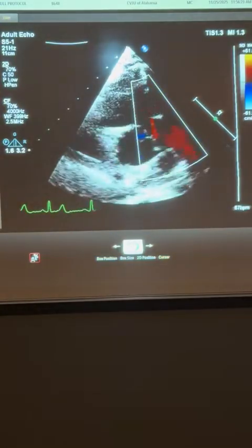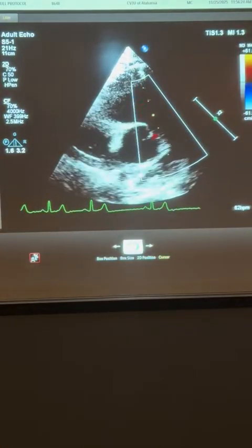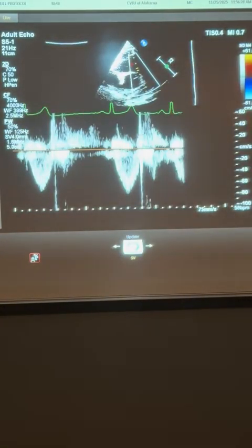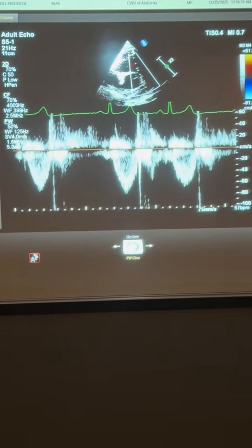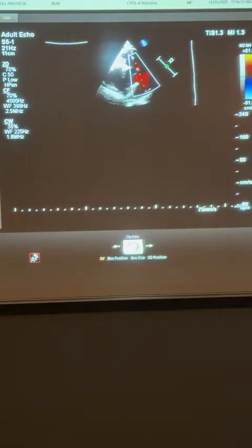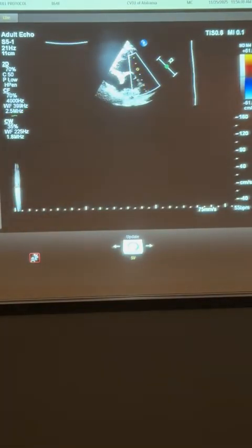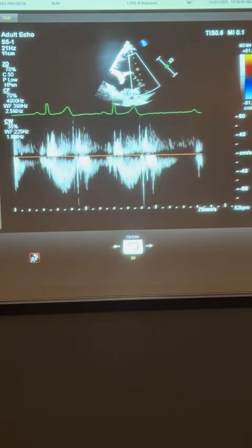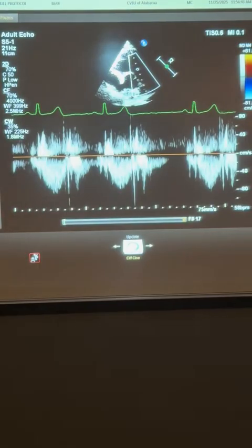We're gonna do our Doppler the same way we did before. So we're going to pulse wave. We're gonna peak. And we're going to continuous wave. I try to adjust my scale, my baseline, my speed, as much as I need to get a really good image. How much of a portion of the screen should be covered in Doppler? 2/3 of the screen.